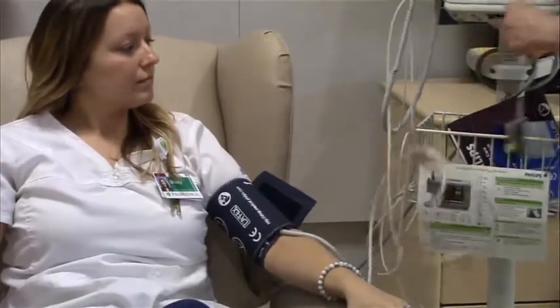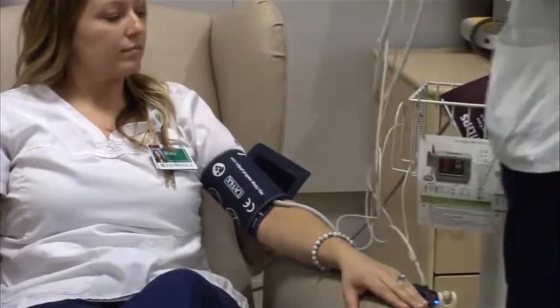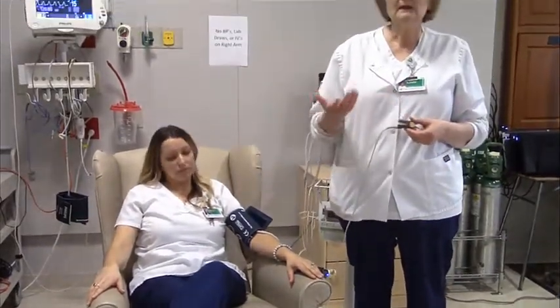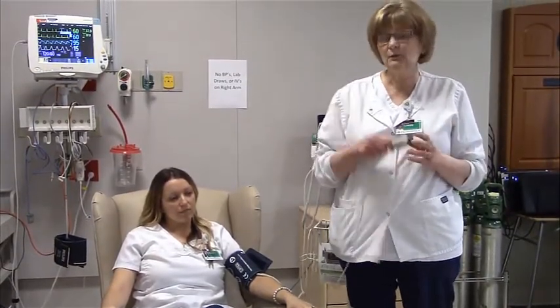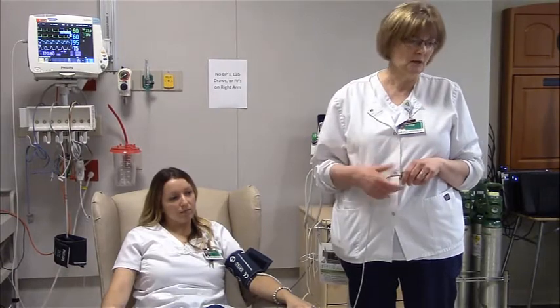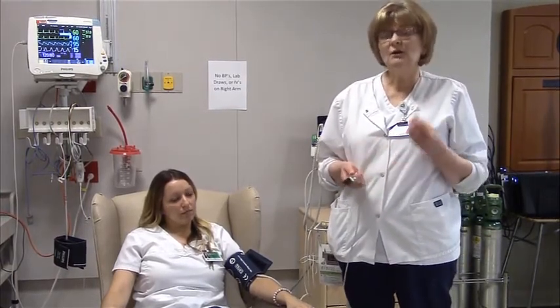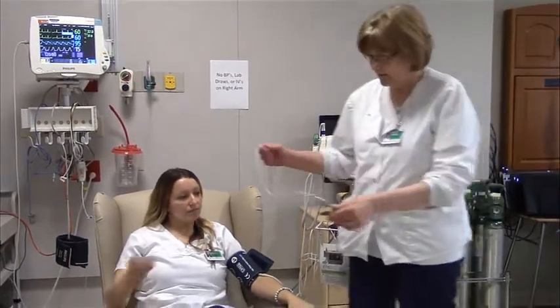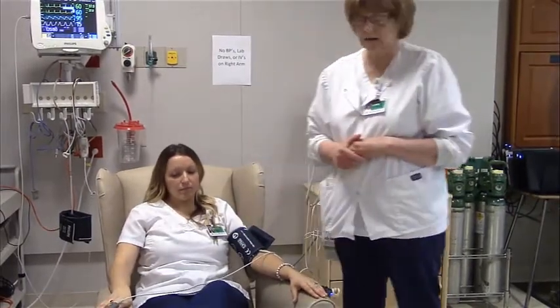The other thing I want to talk to you about while we're doing this is the SpO2. Now this is measuring the amount of oxygen that's being carried by the hemoglobin in the blood. It can be intermittent, which I'm going to do, or it can be continuous. People who have nail polish on or artificial nails sometimes will fool this. You may have to actually remove fingernail polish or try an additional site.